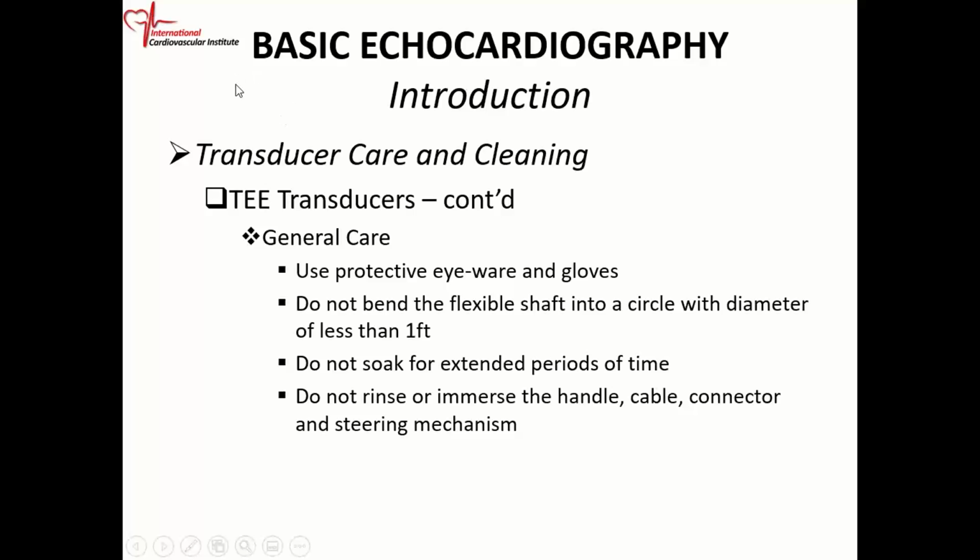Again, you have to clean the transesophageal probe after each use. You have to use gloves, because the cleaning solution can be somewhat toxic. Do not bend the shaft too much, because you can damage the probe.